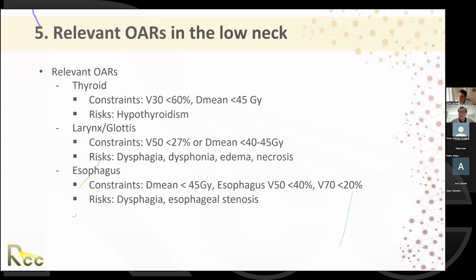We have a question about what constraint do you use for brainstem, especially when you are covering all the retropharyngeal nodes? Yeah. So I mean, 54. If I can do it in a select clinical case, I take the surface up to 60, but that makes me uncomfortable. But yeah, definitely not 66 to the brainstem. 60 would be the hottest I would want to go.